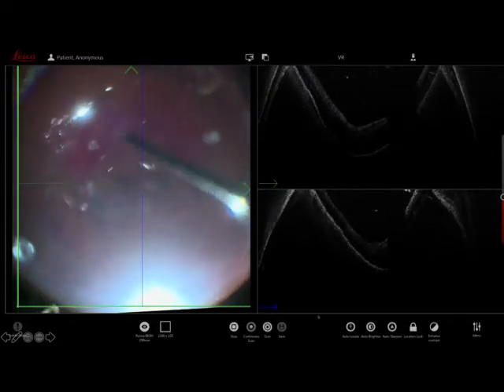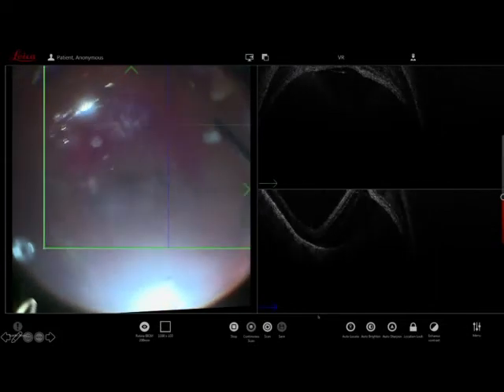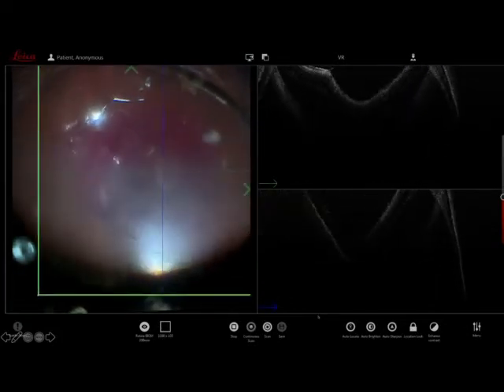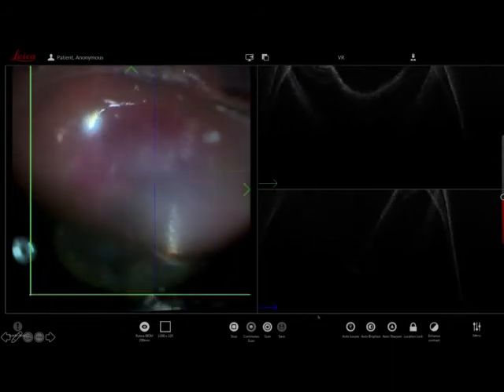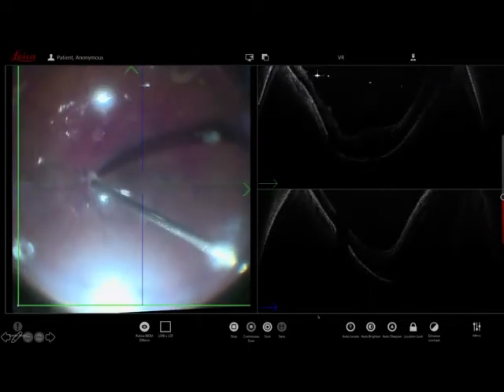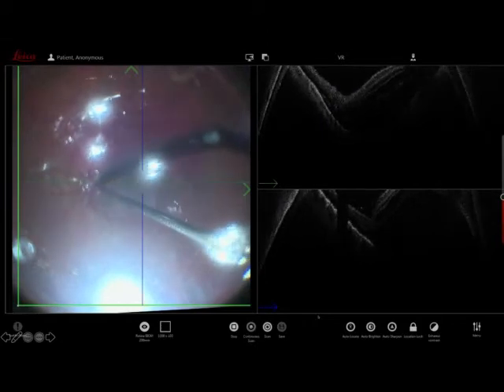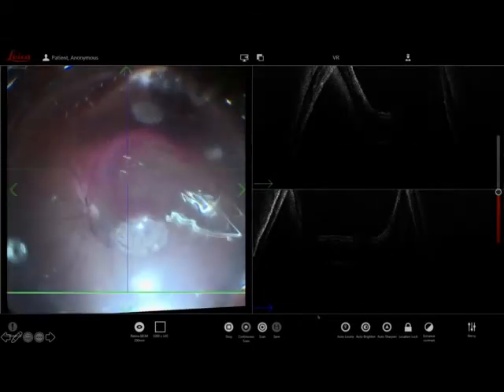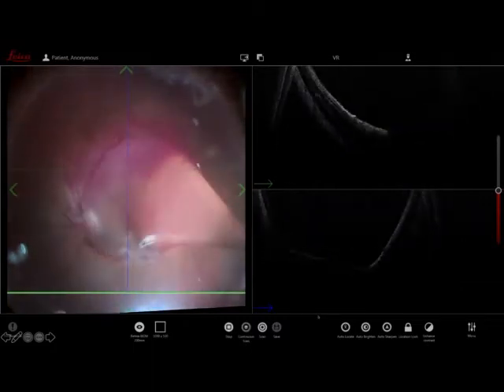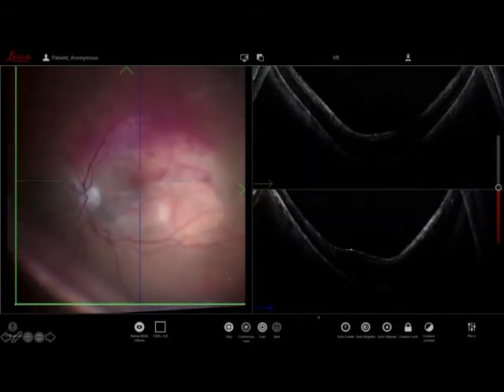during the exchange of air, the macula detaches because there is some residual subretinal fluid that cannot be removed by aspirating through the peripheral holes. It happens all the time, and you see the macula is detaching. And then, interestingly, when I inject heavy silicone oil, the macula flattens again. It's almost like when we inject a PFCL.